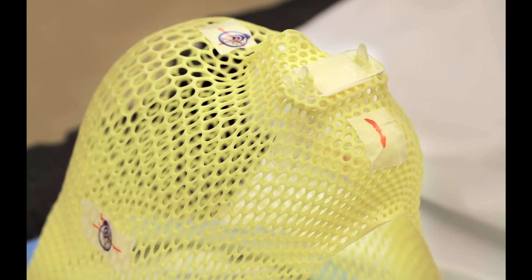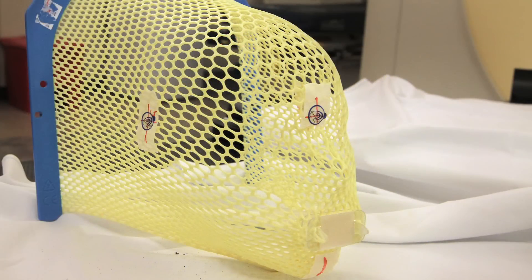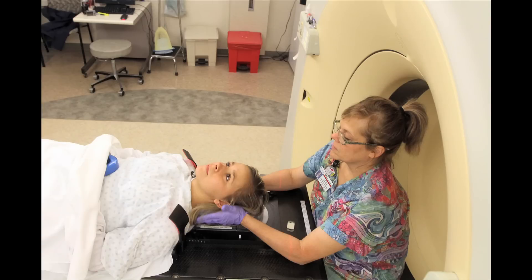You start with having a mask made that fits over your face and head. This is followed by simulating your radiation therapy with a special machine.